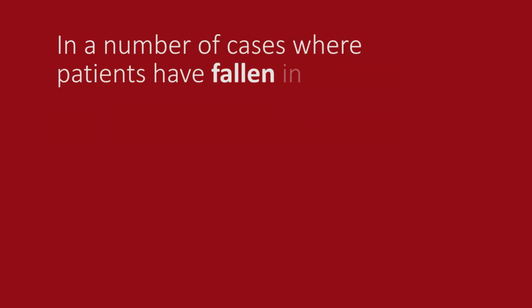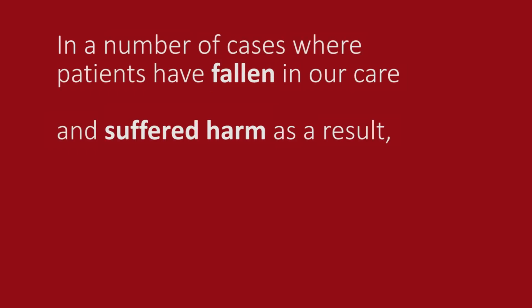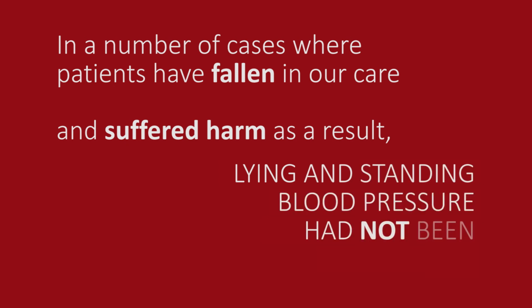It is important that all staff understand how to measure lying and standing blood pressure. This is an important part of assessing a patient at risk of falls. In a number of cases where patients have fallen in our care and suffered harm as a result, lying and standing blood pressure had not been carried out.